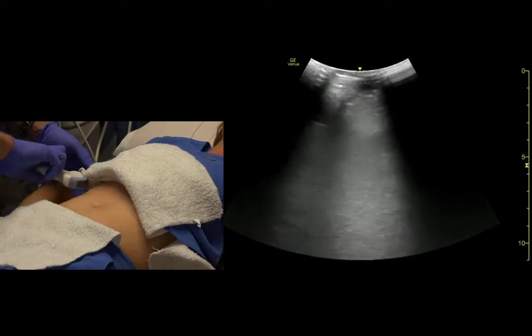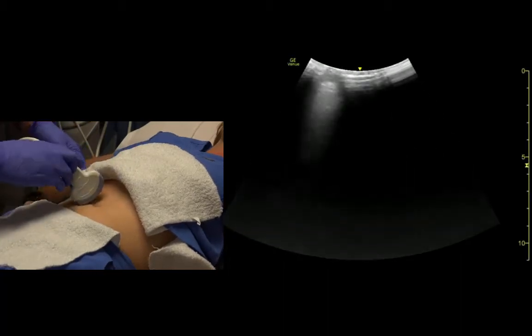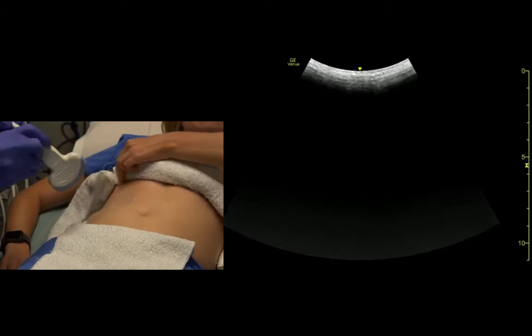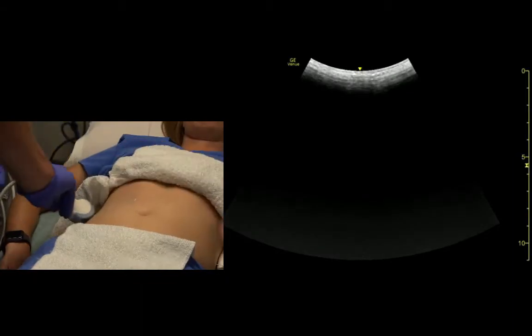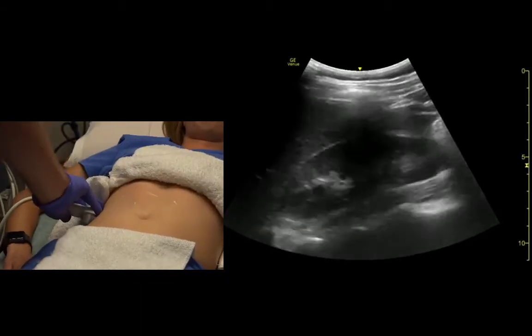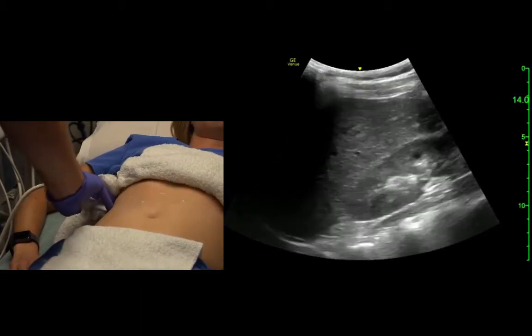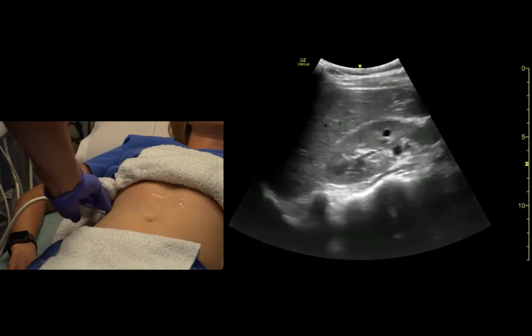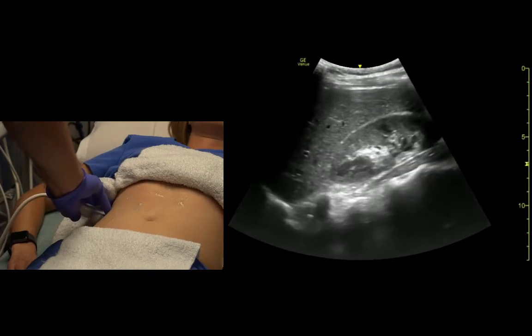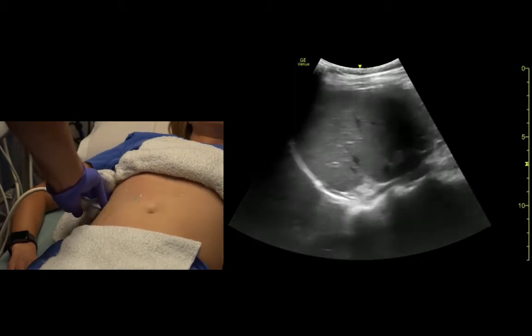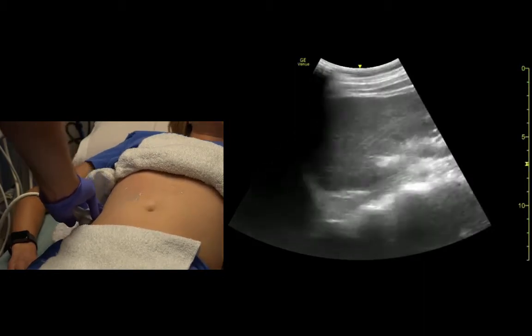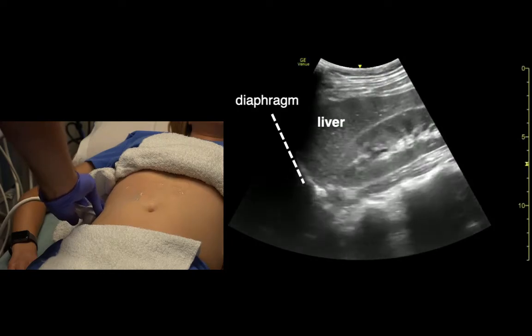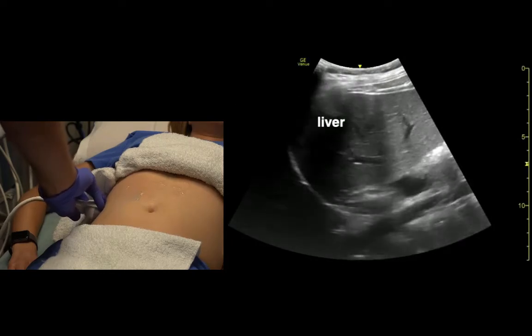If we come from the coronal view of the abdomen, the indicator is towards her head. We find the liver from this view — big breath again — and we see liver below the diaphragm. It's fairly nondescript.